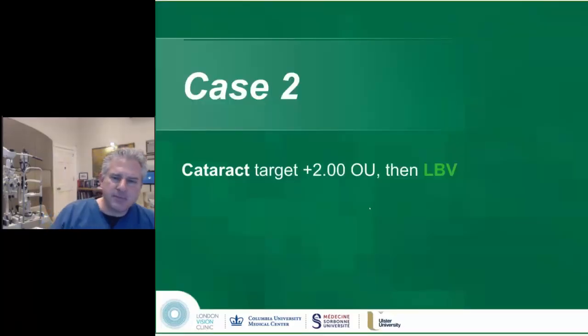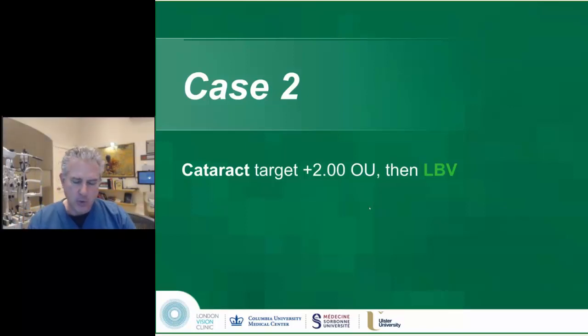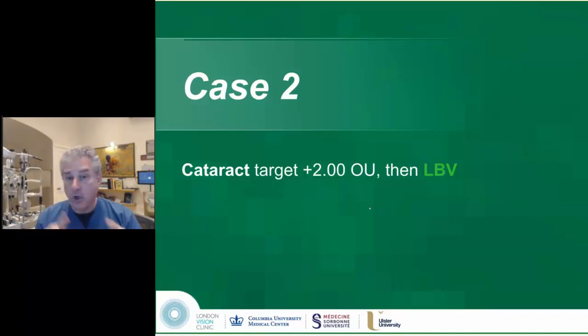Here's the second case. Now, this is what I've called, people talk about premium cataract surgery. And so I call this premium cataract surgery, no really. So premium cataract surgery, comma, no really. And that's because what we're doing is targeting the cataract surgery to about +2 post-op.